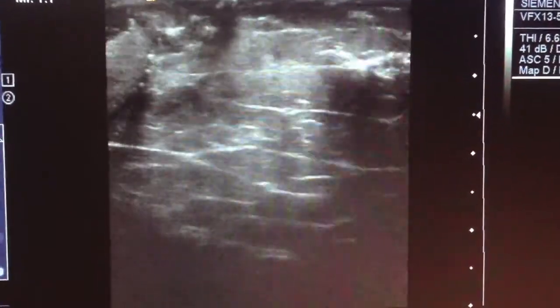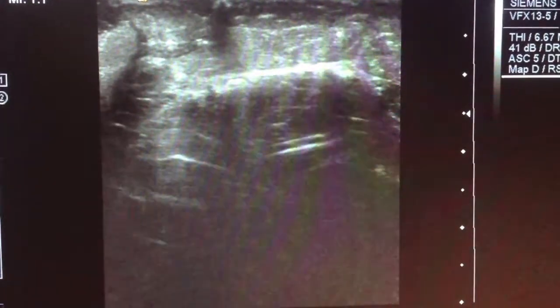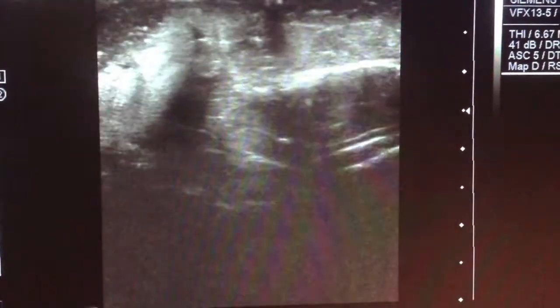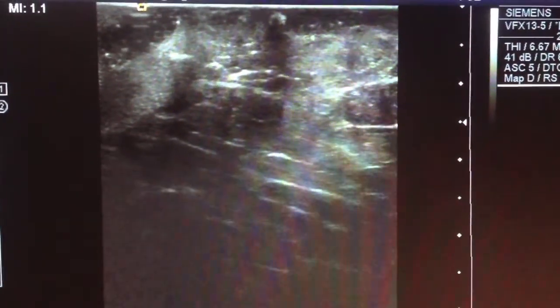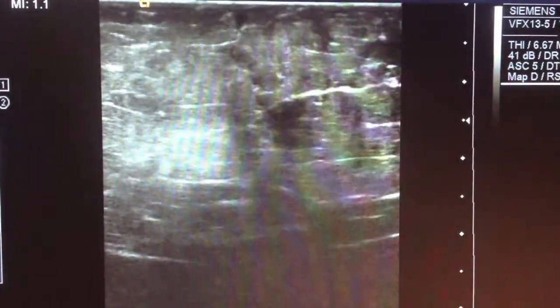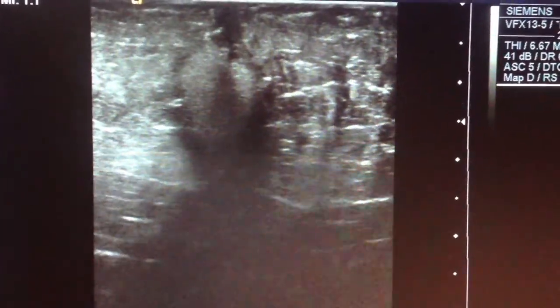While the needle is still in the patient, push the cannula forward until it gets to the place you want. Then take the needle out, throw the biopsy in the pot, realizing it's probably just normal breast tissue. And now when she takes that needle out, scan across there, Nicole.